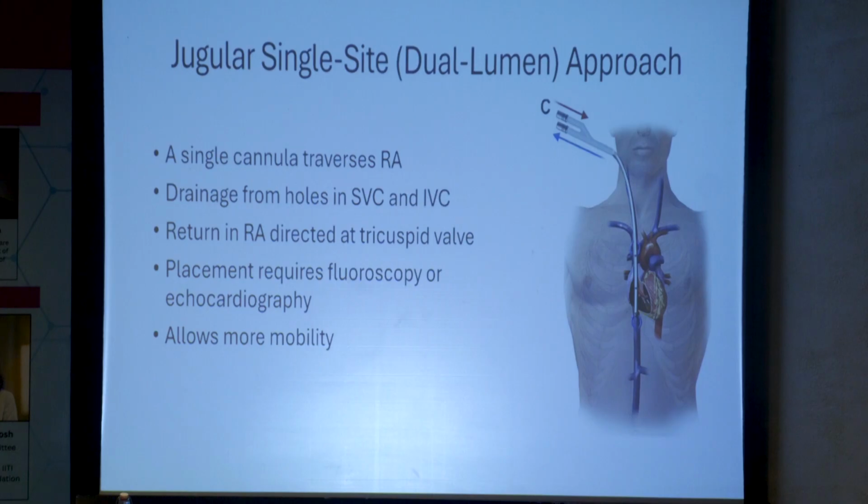Mobilization. So the biggest advantage is mobilization. So there are a group of people where we are thinking of lung transplant or whatever. They are on ECMO support, and we take off the ventilator support. So they are mobilizing and they are walking around. If you have decided as a bridge to lung transplantation, that's the biggest advantage of the neck cannula. They are mobile, they are walking, and then we say, okay, now they are literally ready for a lung transplant.